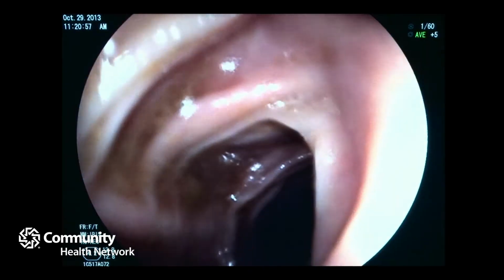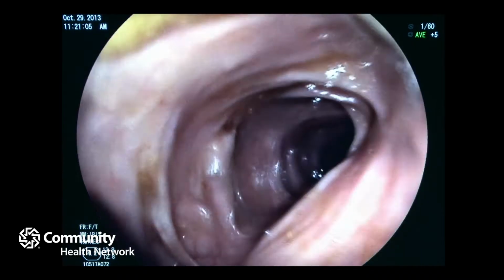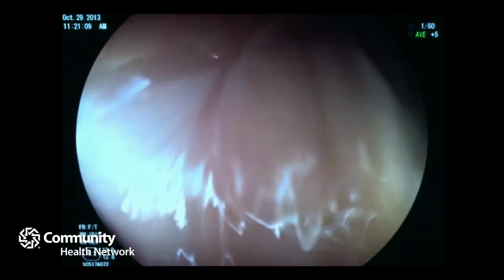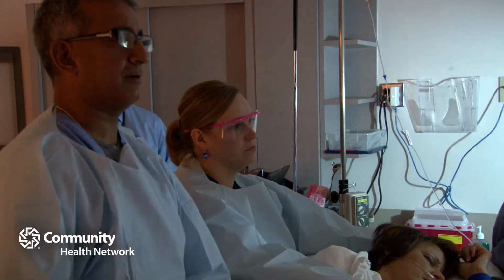So in her, I probably won't wait the standard 10-year guidelines, just because the prep really was not what I would consider to be good or excellent. I would consider this to be fair at best, and so I would push her to the 5-year mark. There would be some that may agree or disagree, but I firmly believe that it has to be perfect to recommend that 10-year mark.